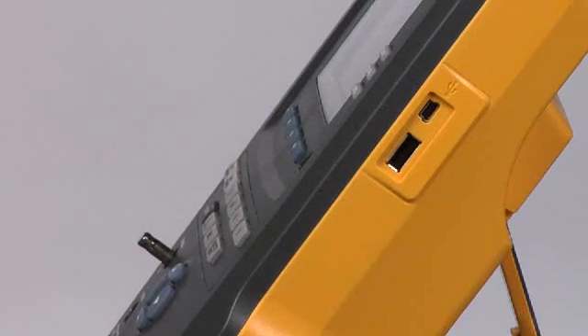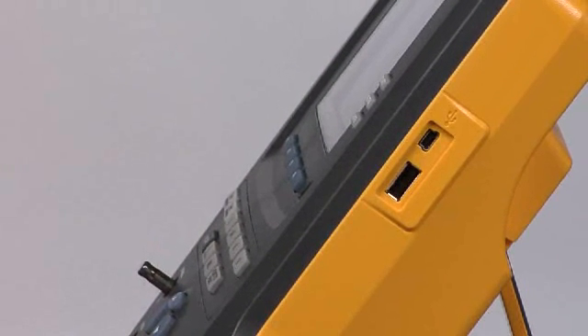Moving up higher on this side of the device, we see the USB ports — there are two of them. The mini USB port is for connecting the ESA615 to your computer, for instance running the ANSUR test automation software or the ANSUR mini plug-in for the ESA615. The larger of the two USB ports is for connecting keyboards, barcode scanners, and the like.